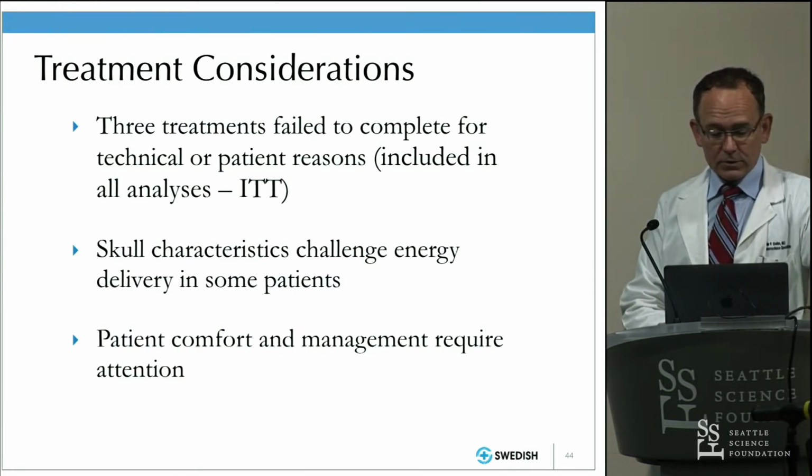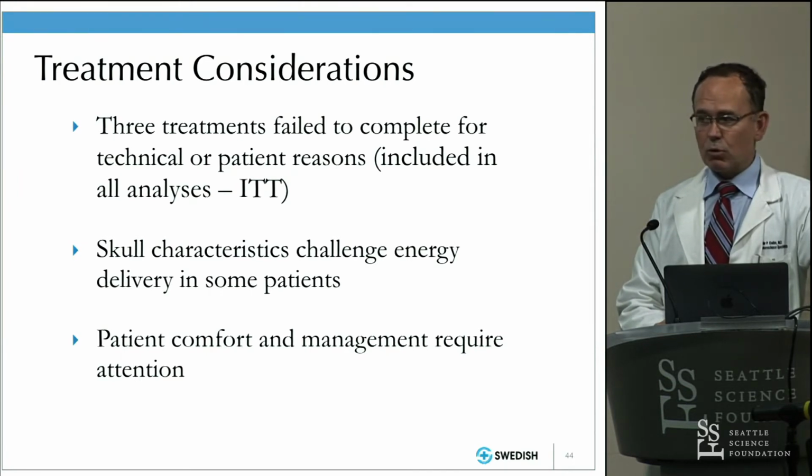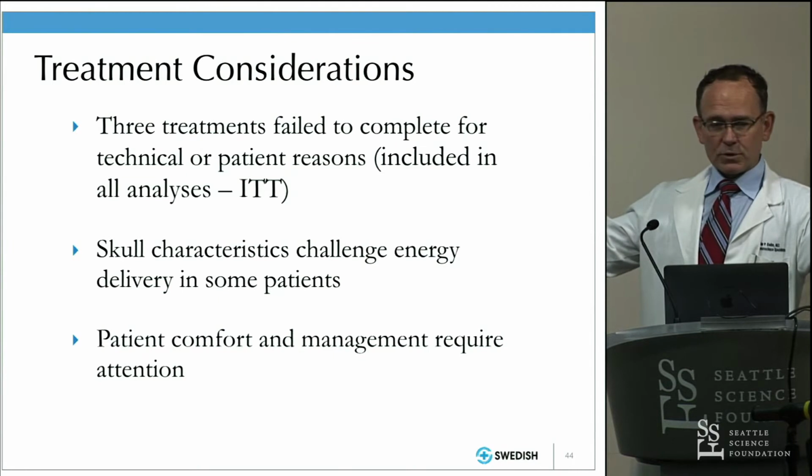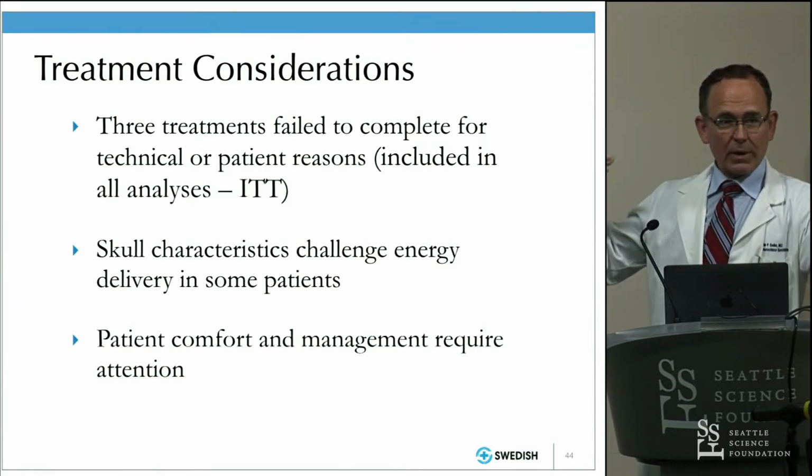We did find out through this trial that there were people that are ineligible for focused ultrasound because of the anatomy of their skull. Either it's too thick or it's too corrugated. So the ultrasound waves basically either are absorbed or reflected more in some patients than in others.